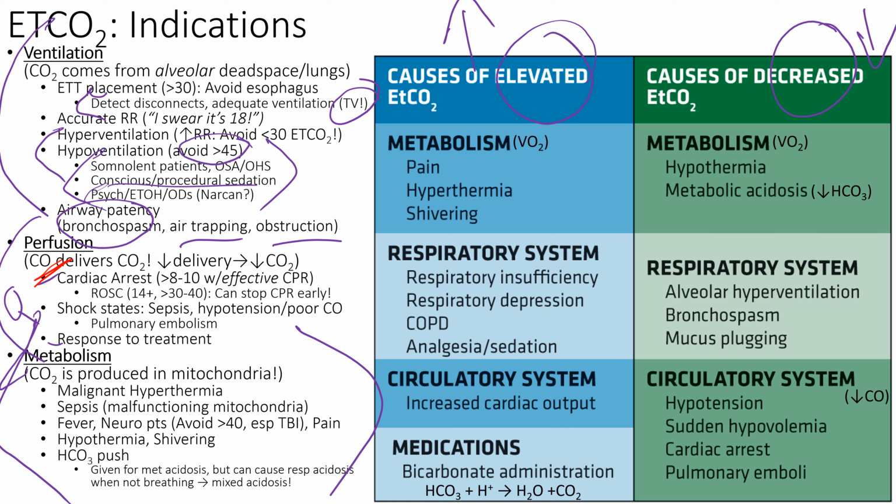But they're not. You realize that you check your NIBP and it's line/line, and you check it again at 15 minutes, line/line, and my end tidal CO2 is now 18 and then 12. That means your patient doesn't have a blood pressure, right? So it's a way to know in real time approximately what their blood pressure is, that they're getting a blood pressure, I should say.